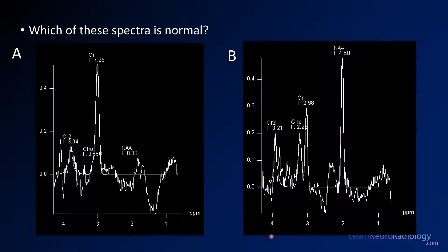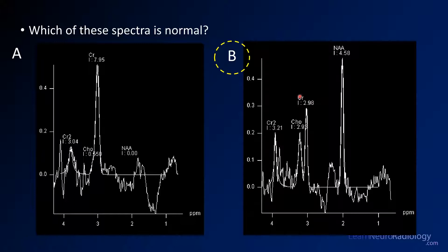Here we have two MR spectra — tell me which one is normal. Clearly B is the normal spectrum. The three peaks you're most concerned about are choline, creatine, and NAA. Choline is a marker of cell turnover; creatine is an energy metabolite serving as a relatively normal baseline; and NAA is a marker of normal neurons. The markedly abnormal spectrum shows very little choline, almost no NAA, a creatine peak, and a lactate peak — an inverted peak around 1.3 ppm.